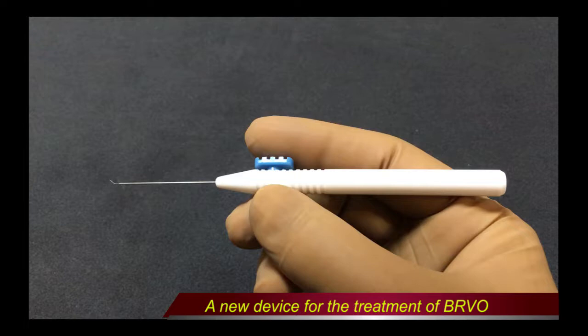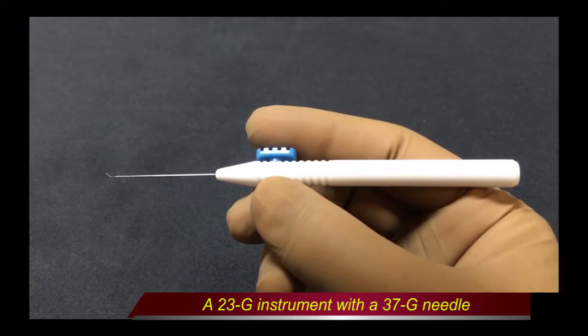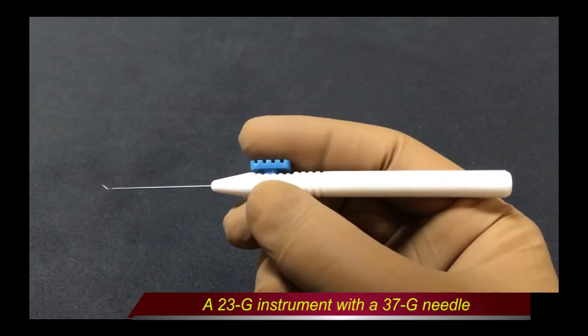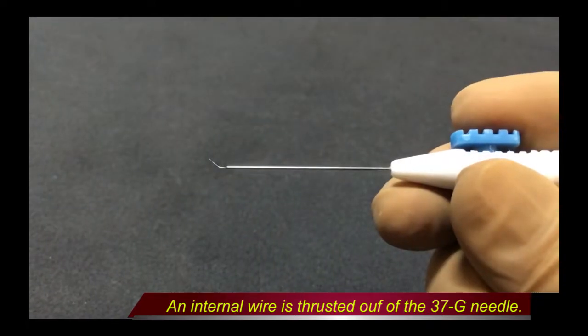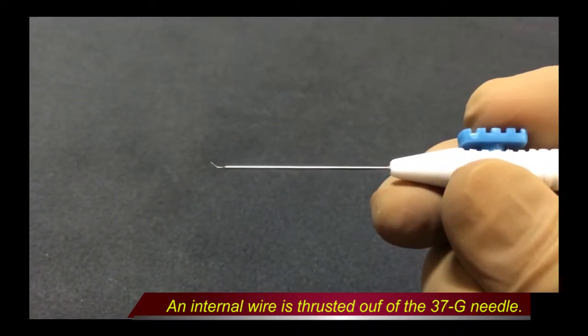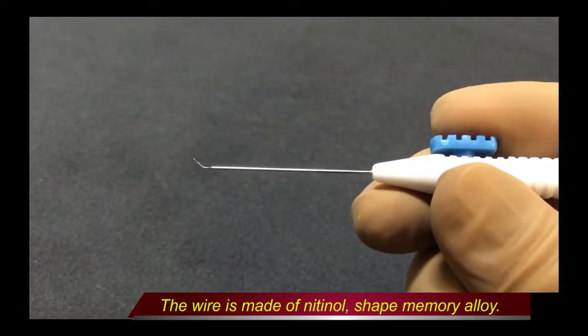Therefore, we developed a new device for the treatment of BRVO. Our device combines a 23-gauge instrument with a 37-gauge needle. By sliding this projection, a wire made of the shape memory alloy nitinol is thrusted out of the 37-gauge needle.